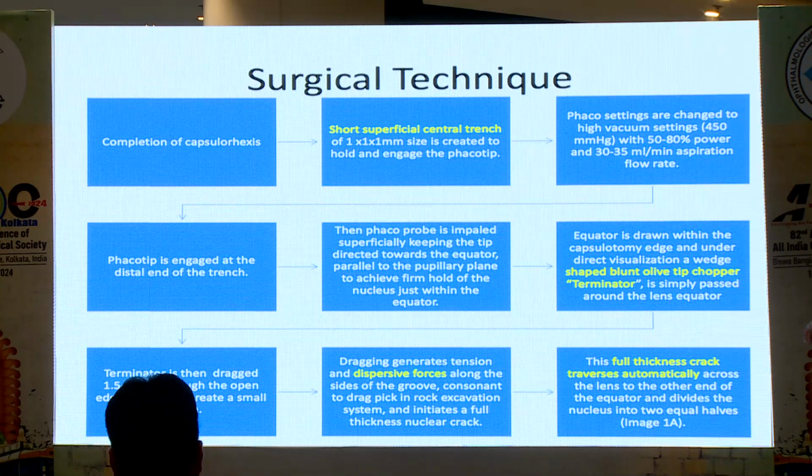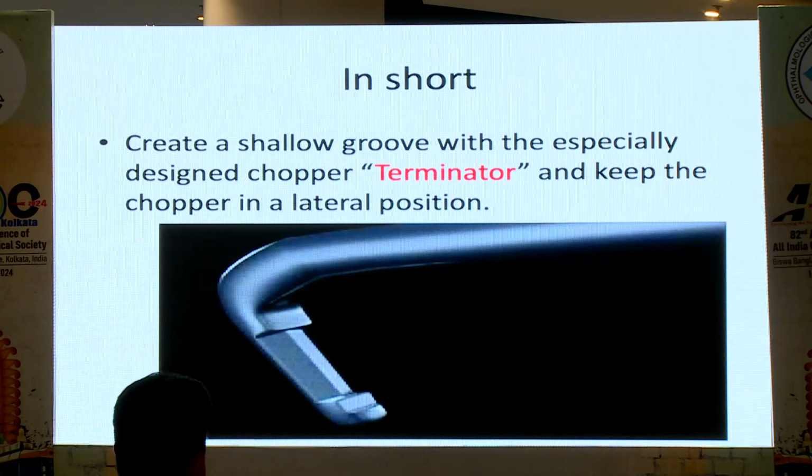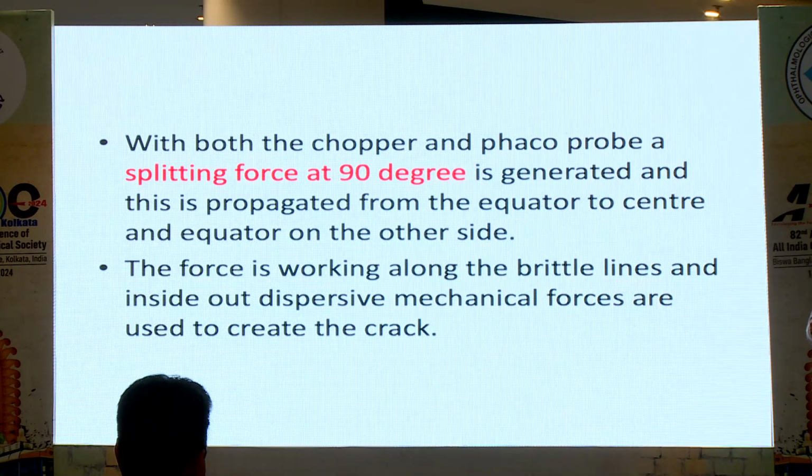So this dragging generates tension and dispersive forces along the sides of the groove, consonant to a drag pick in a rock excavation system, and initiates a full thickness nuclear crack. And this full thickness crack traverses automatically across the lens to the other end of the equator and divides the nucleus into two equal halves. So this is the terminator chopper. It creates a shallow groove with a specially designed chopper, keeping the chopper in a lateral position. With both the chopper and the phaco probe, a splitting force at 90 degrees is generated, and this is propagated from the equator to the center and the equator on the other side.